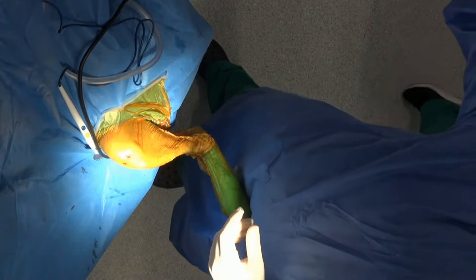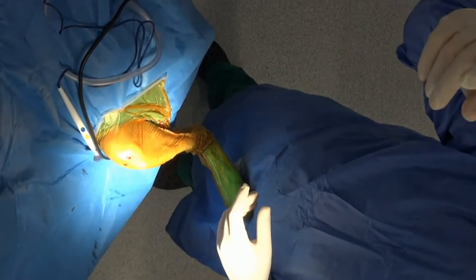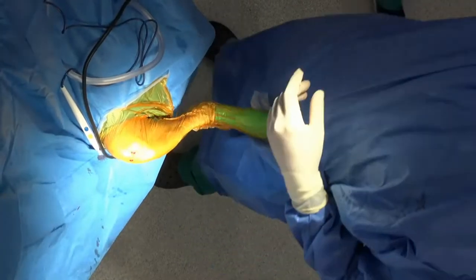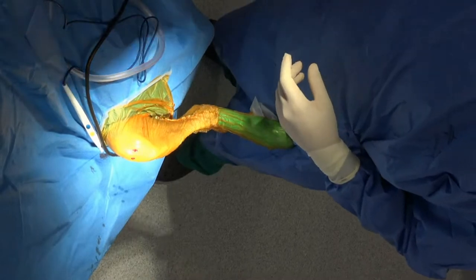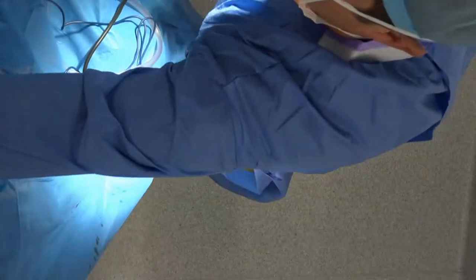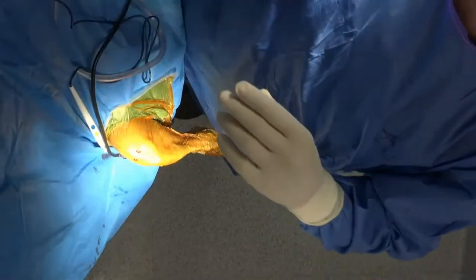Janine, can I get that light turned on, please? And we're doing a CBLO because this dog has got a tibial apophysis that's still not fused onto the tibia. So we're going to do a CBLO because it's going to minimize the risk of having problems.